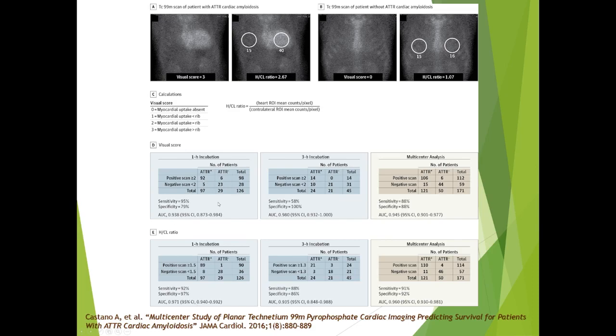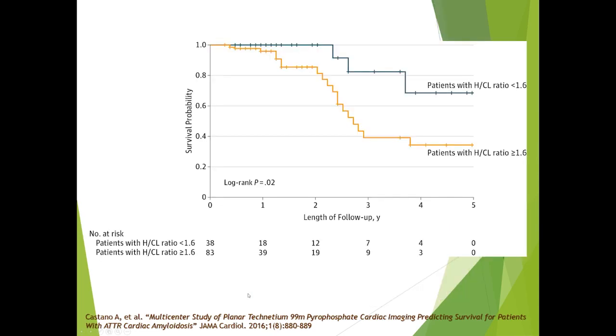In terms of the sensitivity and specificity, overall you could probably get away with 1 hour. But again, as I mentioned, if there's significant blood pool activity, you may be better off in some cases doing a 3 hour image, because the specificity in those cases may be better.